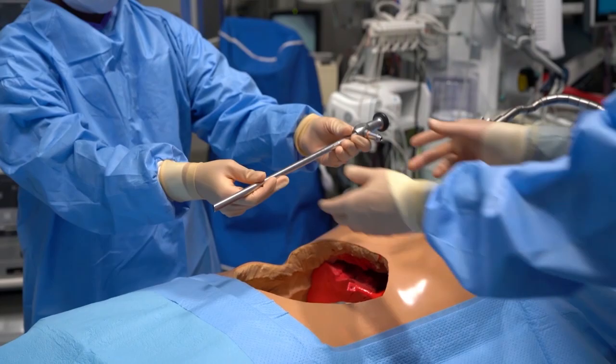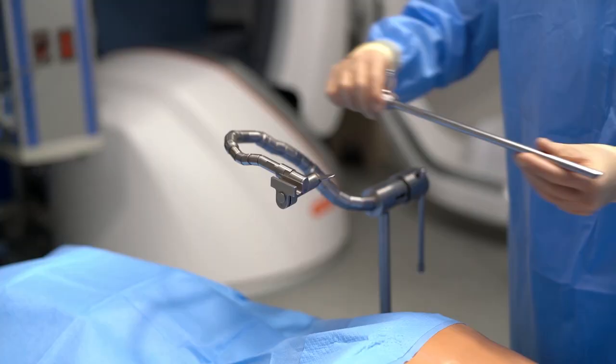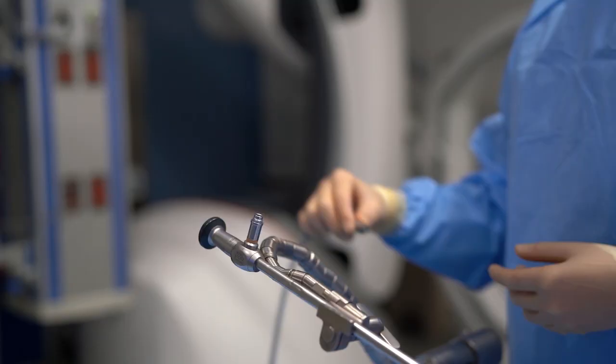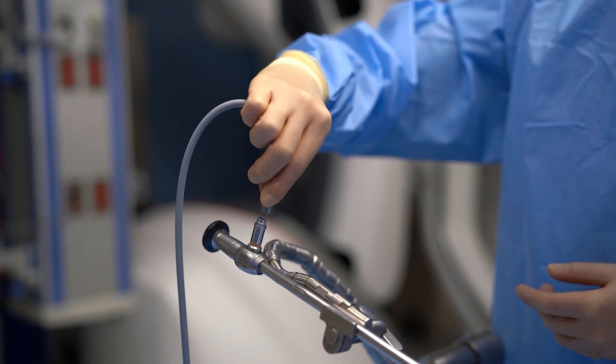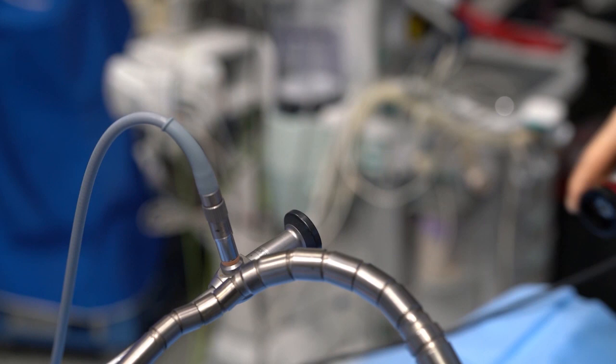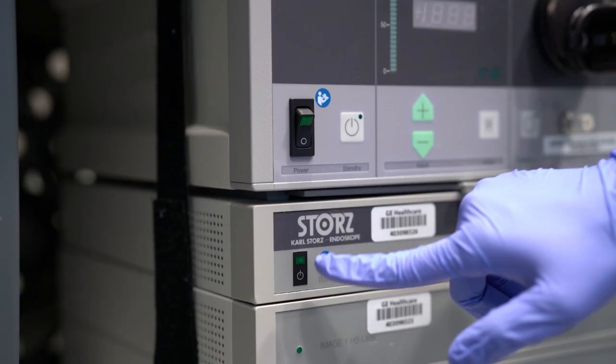This actually provides several advantages. First of all, it illuminates the field. Secondly, unlike an overhead light, the physician does not get their head in the way of the camera. And this also allows you to offset, because of the 30-degree nature of the endoscope.